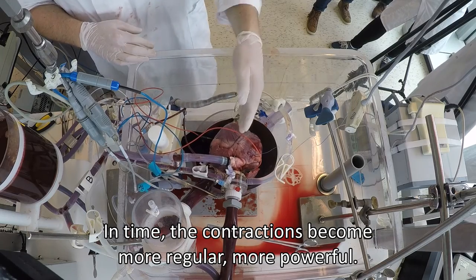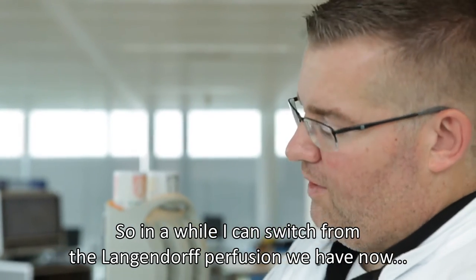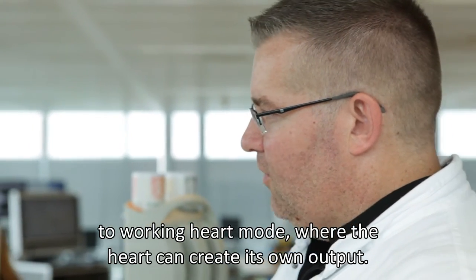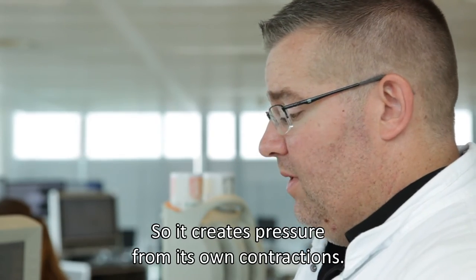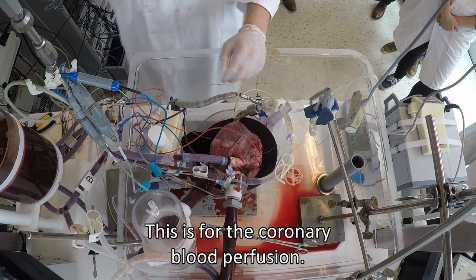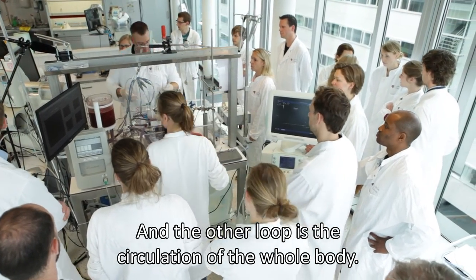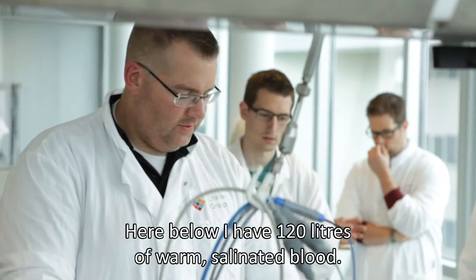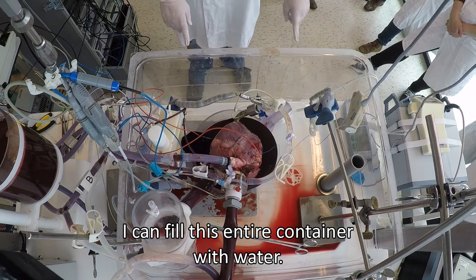Then I transition from the Langendorff — which we are doing now, a perfusion of the aortic root — to having the heart generate its own output. So we now have two loops: one for the coronary blood, and another loop that ensures the heart will work. I have here about 120 liters of warm water.